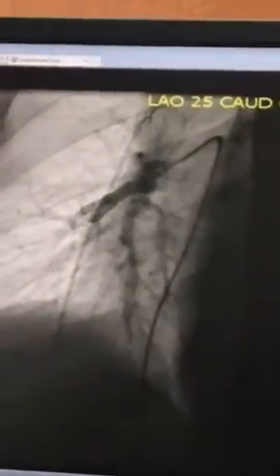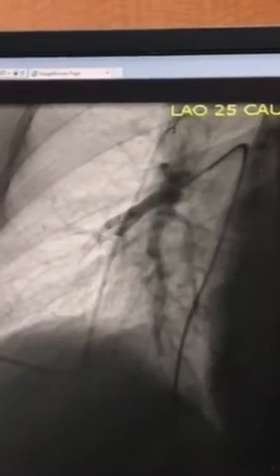Here's another shot as we're in a different branch. So if you compare this shot with the first one, that's basically the vessels sort of stop here. Now we've got vessels that are filling all the way out here. They don't look perfect yet. No, but in time. Exactly. So that's the hope, that in weeks, time, it could still... exactly. And your pressures are still not low. Your mean pulmonary pressure was right around 40. Your cardiac output is better than it was beforehand.